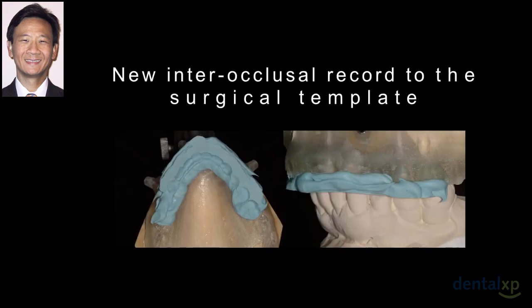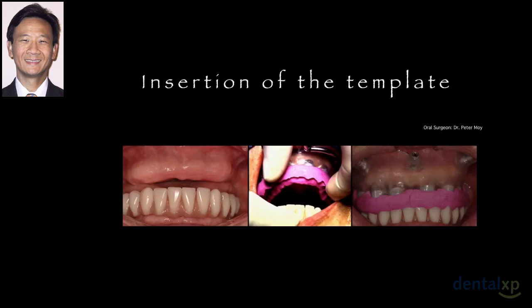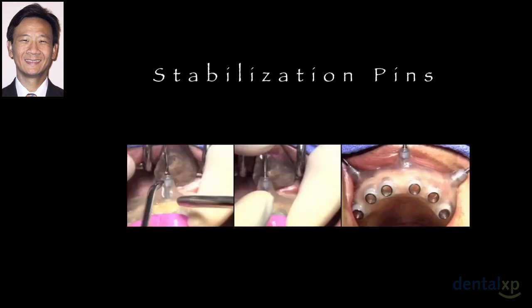A new surgical index was created based upon that centric relation position of the mandibular arch to the maxilla. That was cross-mounted in the laboratory. The surgical procedure that we used was insertion of the surgical template, making sure that everything was passively fitting. And we had 3 stabilization pins to hold or anchor that surgical template in the correct interocclusal record. After placement of those stabilization pins, the patient was allowed to open, giving access to the surgical sites.